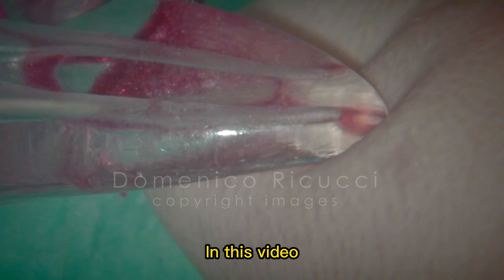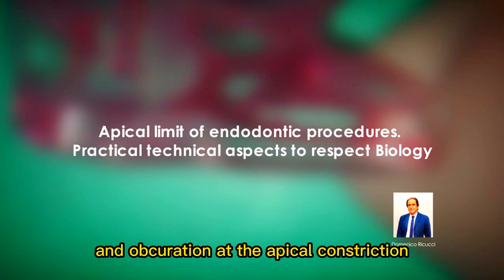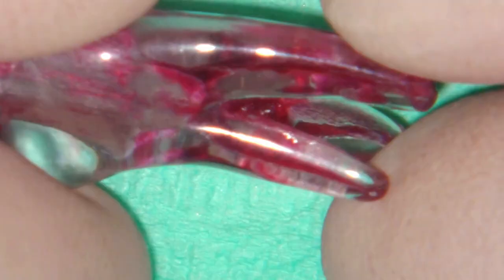In this video, it is my intention to discuss technical aspects concerning the termination of endodontic instrumentation and obturation at the apical constriction, according to the principles of the endodontic biologic school.